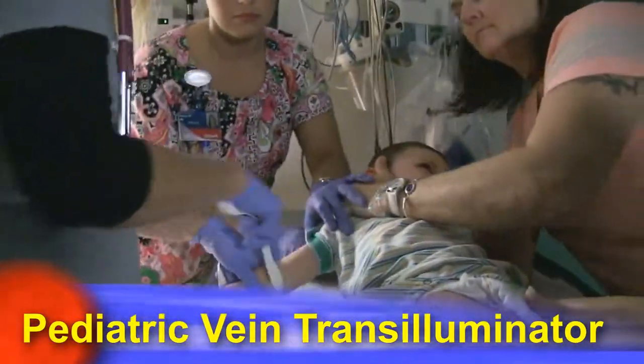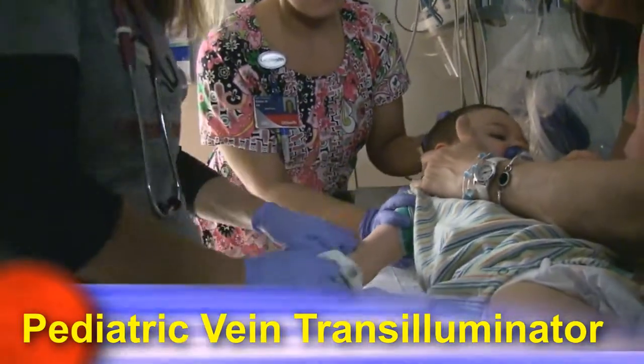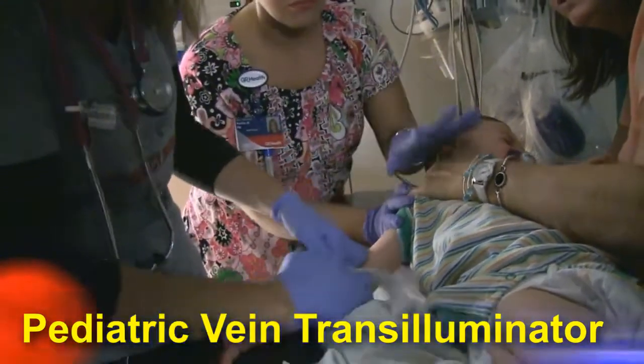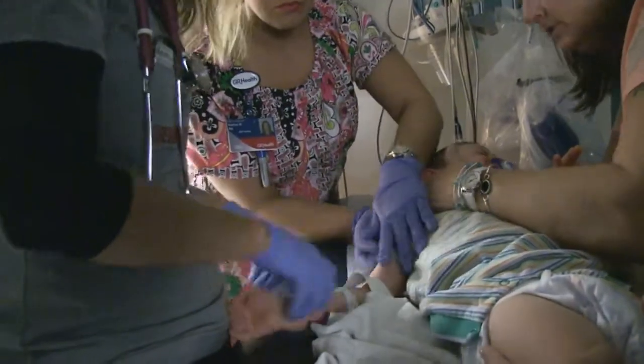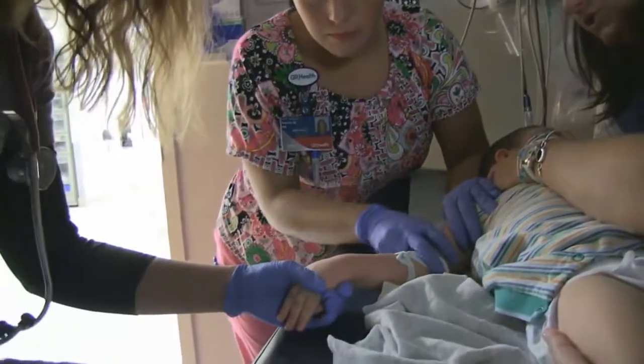This is a nursing procedure video and we're going to demonstrate how to find a vein on a patient that is a difficult stick — difficult to put an IV in.